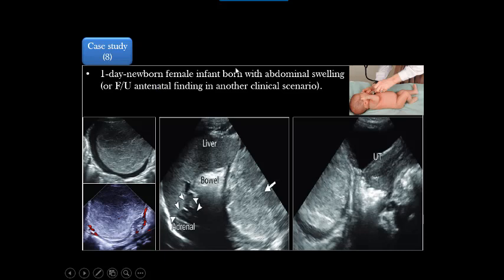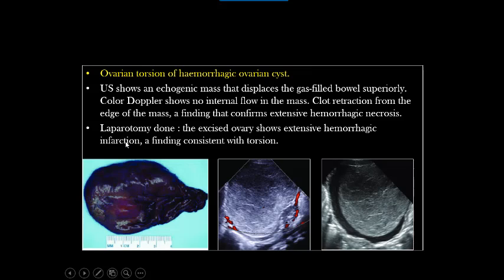The last case in this group: a complex cystic lesion starting downward from the superior aspect of the uterus and urinary bladder, reaching up to the liver and compressing the bowel and stomach posteriorly, located at the midline. It contains no perceptible vascularity and has a fishnet, reticular, or lace-like appearance — exactly like an adult hemorrhagic ovarian cyst. This is therefore also a hemorrhagic ovarian cyst.